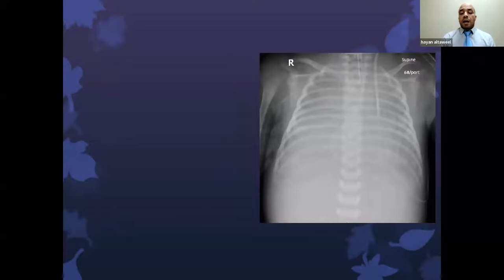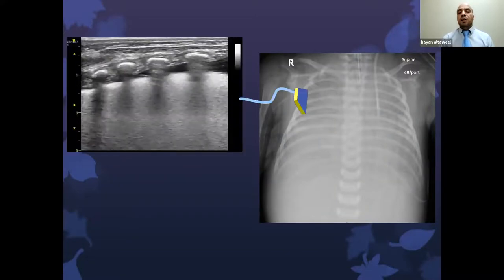Another example: if you have a patient with this chest X-ray, I think nobody will elect to give extra fluid to maintain his hemodynamics. But if you are waiting for the X-ray technician to come and the X-ray to be done, or you are giving fluid and then need to check the result of the fluid given, and your patient is still hemodynamically unstable, I can easily do an echo and I can repeat it whenever I like.